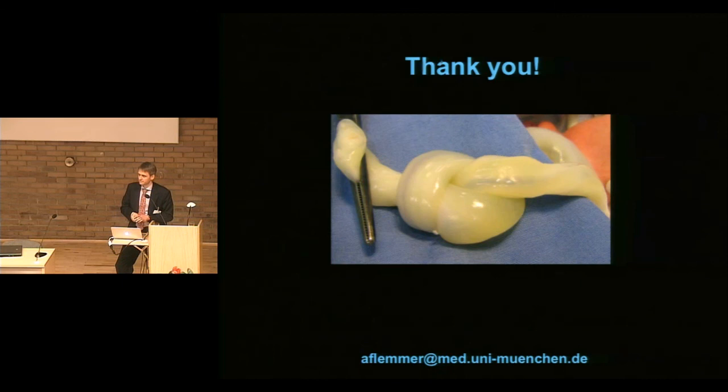You're not afraid of blood clotting at the end of the tip when you cut it? Because it's not plain anymore. The one you could cut, the Vygon with the splint, we don't have it anymore. But when we used that, we cut it only outside of the patient, not the tip, where the splint is connected to the PICC line. So this is not affecting the tip at all. I would be very careful to cut the tip.